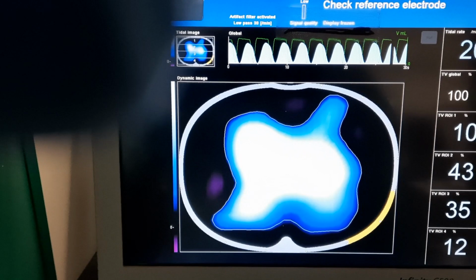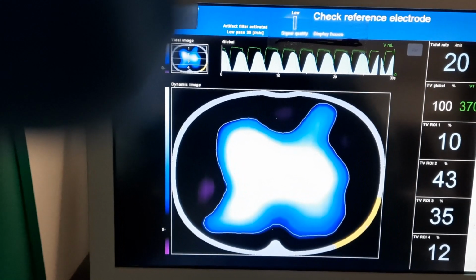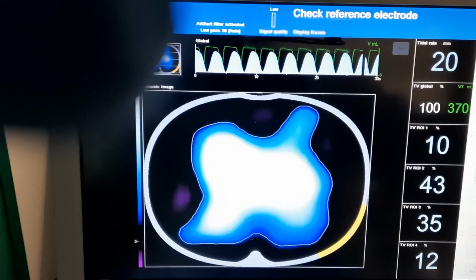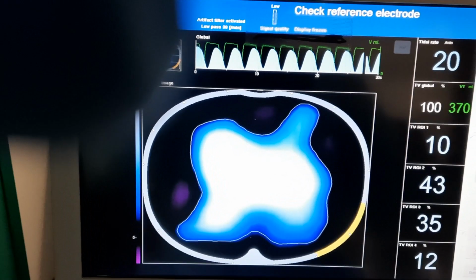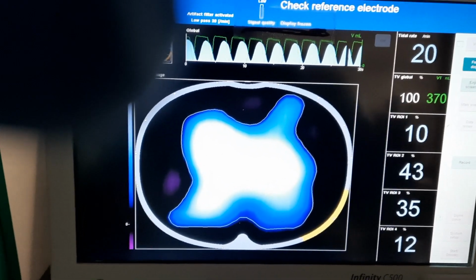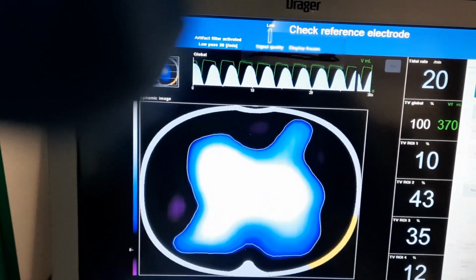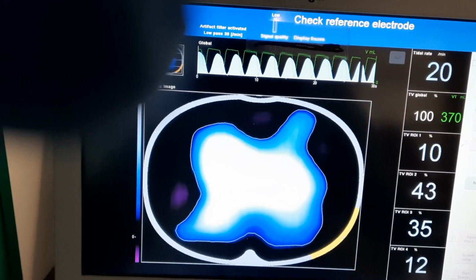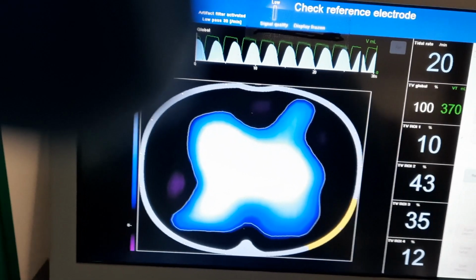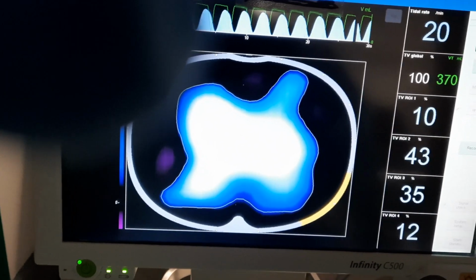APRV. We titrated and did a P high trial, and the optimal P high was 30 to 32. That doesn't mean now that the patient is on their stomach that 30 to 32 is optimal. Still, it's kind of like doing a PEEP study. Let's say the patient needs a PEEP of 16 because recruitment's occurring at 16, but within 8 to 12 hours, perhaps that 16 is no longer necessary. We can maintain that recruitment with less.